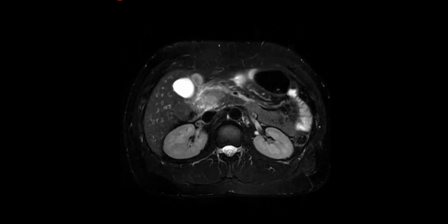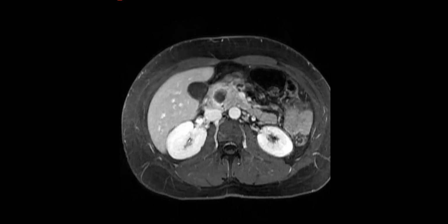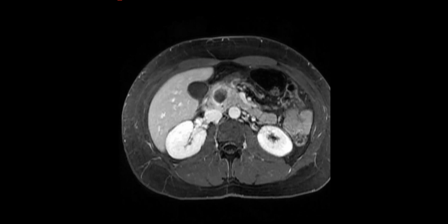It doesn't look like a serous cystadenoma. It doesn't have a capsule in the tail for mucinous. Doesn't look tubular for IPMN. Is there anything on diffusion that is helpful? Let me show you diffusion. But a purely cystic neuroendocrine tumor may not show, or may show shine-through. Yeah, this is a really old study, so we don't have a diffusion. Sorry. No worries. And then I want to show you.